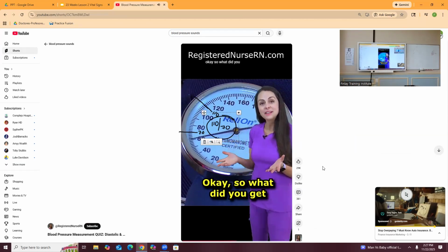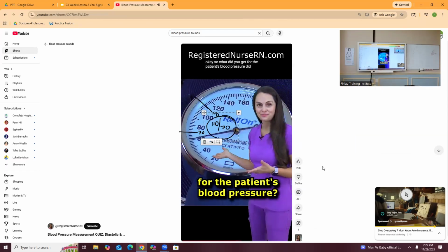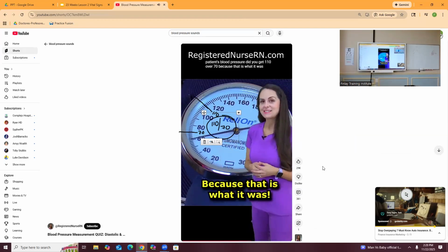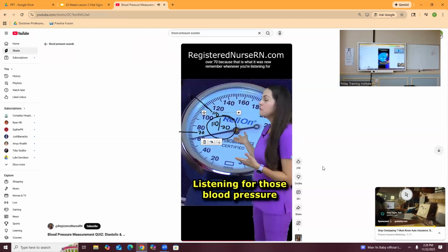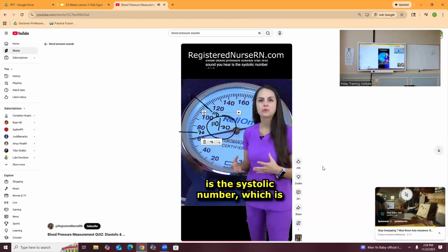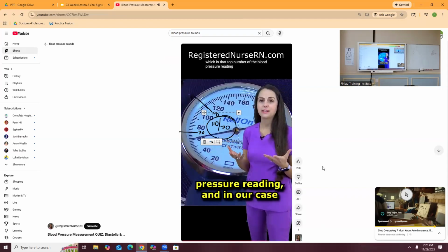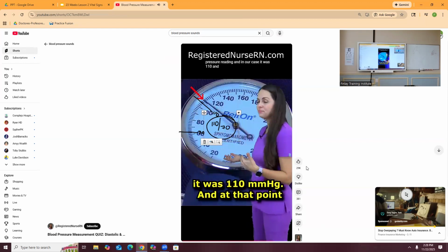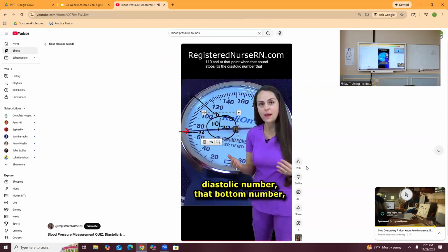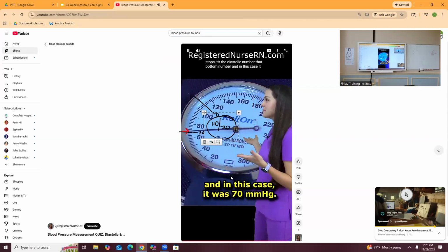Okay, so what did you get for the patient's blood pressure? Did you get 110 over 70? Because that is what it was. Now remember, whenever you're listening for those blood pressure sounds, that first sound you hear is the systolic number, which is that top number of the blood pressure reading. And in our case, it was 110. And at that point, when that sound stops, it's the diastolic number, that bottom number. And in this case, it was 70.